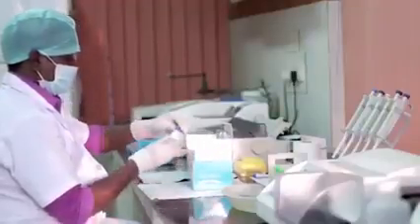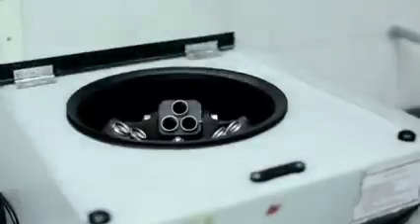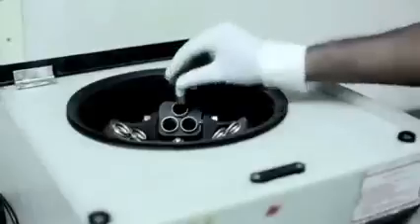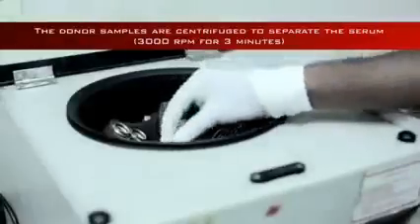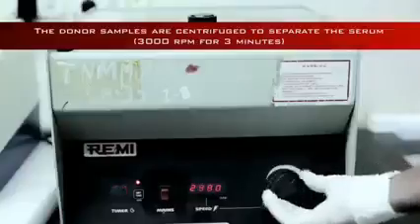Test kits, reagents and samples are brought to room temperature. The donor samples are centrifuged to separate the serum, 3000 rpm for 3 minutes.